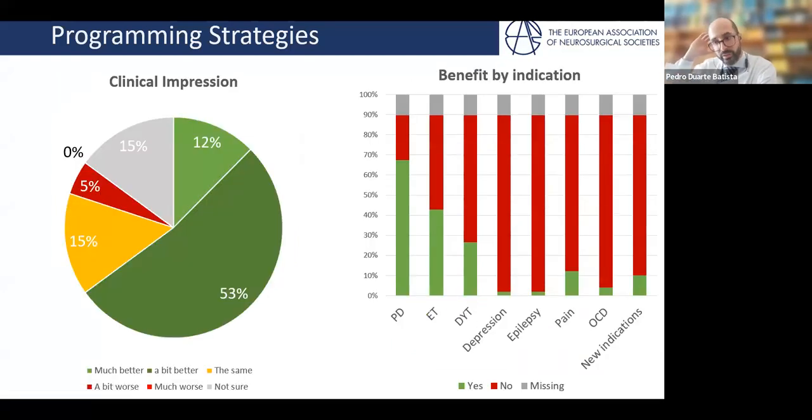And do the patients fare better with these programming strategies, with steering? Most of our respondents think they do, at least a bit better. A bit more than half thought that they fared at least a bit better, and only 5% thought that they fared a bit worse, and no one thought that they fared much worse.